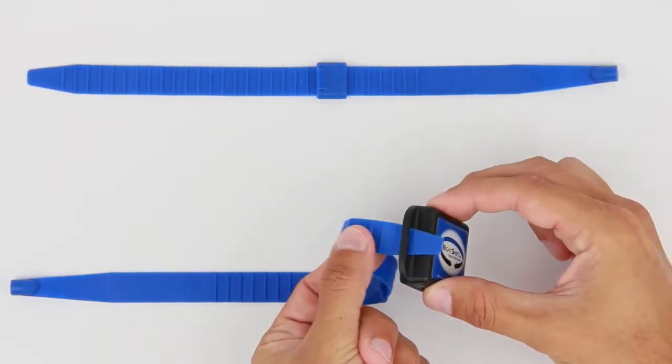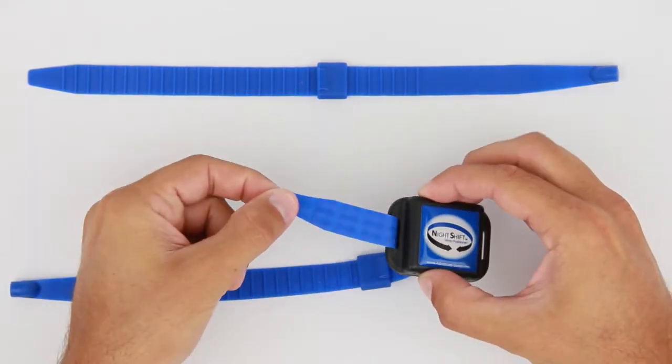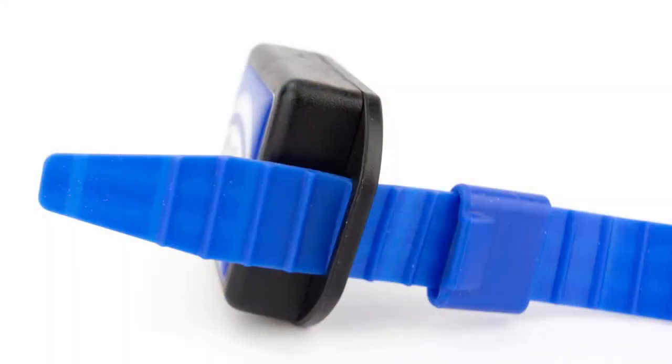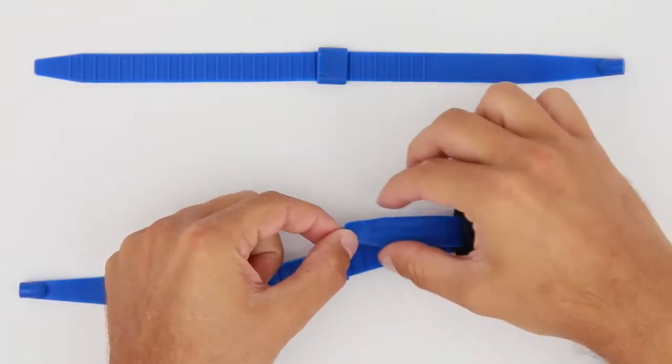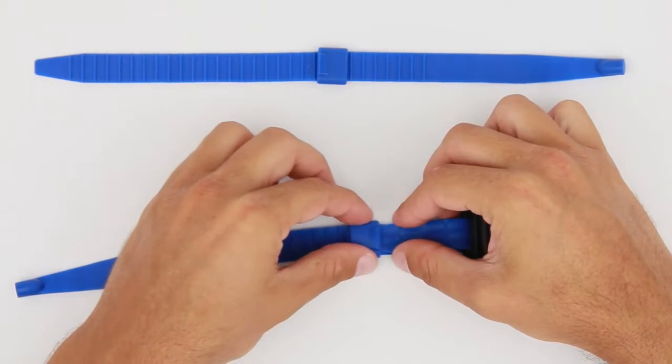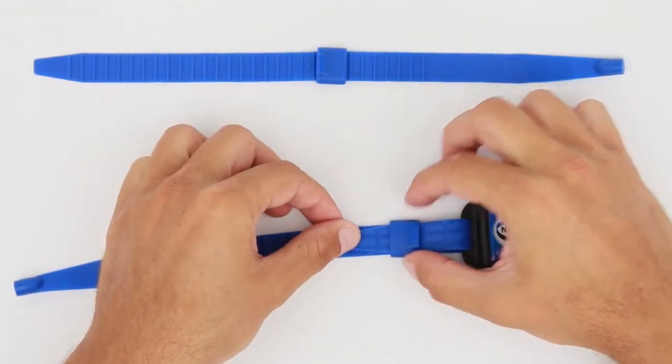Begin by feeding one end of the strap through one of the slots on the side of the device. The strap should be fed through from the back to the front of the device with the ridged side facing out. Loop the strap back and slide it through the retention band. Pull the strap through the band just enough to hold it in place.